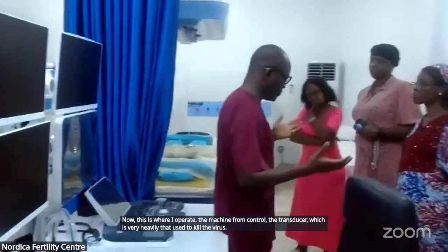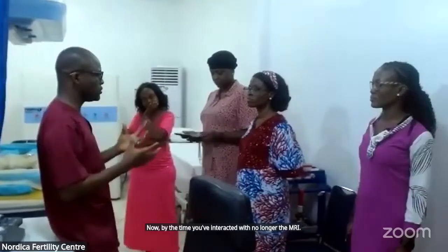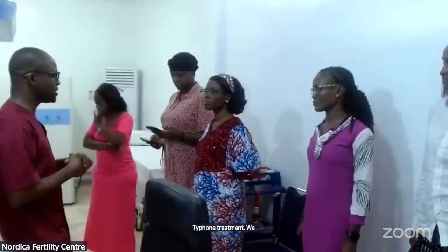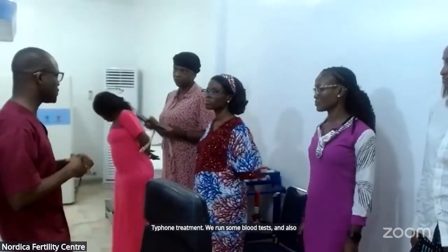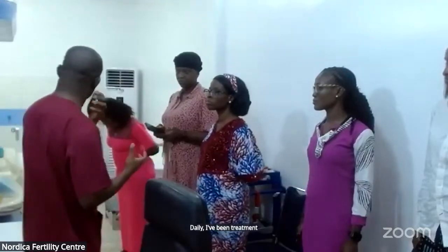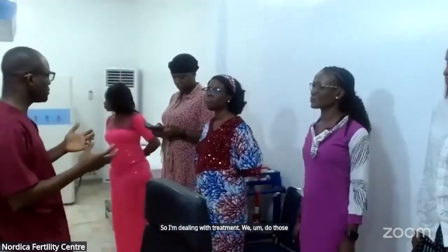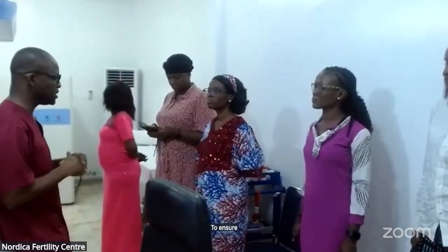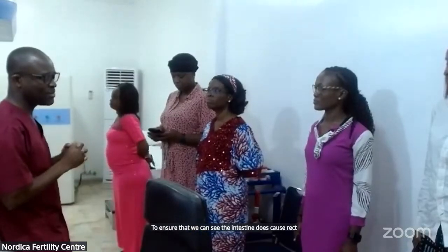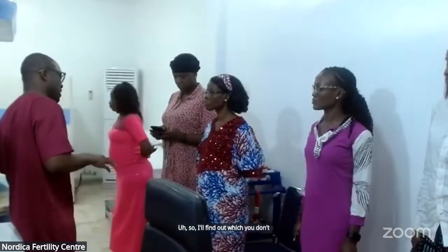By the time we've interacted with you and looked at the MRI and we say you're suitable for the HIFU treatment, we run some blood tests and also give certain instructions regarding your diet before the treatment. On the day of the treatment, we do a little procedure to empty the intestine. We call it rectal washout. After that procedure, we put the patient on the machine.